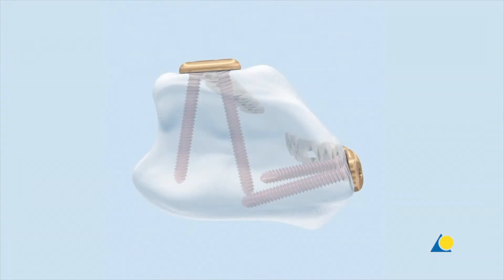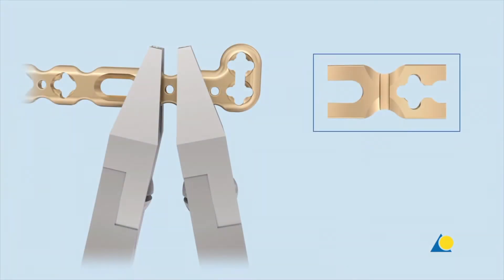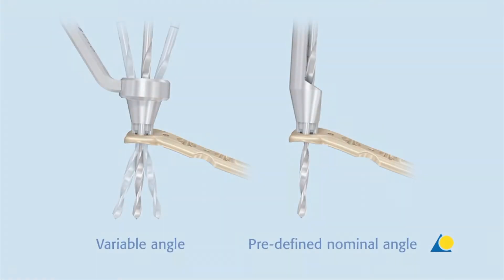The plates are positioned at an angle of 70 to 90 degrees to each other and are pre-contoured to minimize the need for contouring. If contouring is necessary, undercuts and bending notches allow easy contouring while preserving the variable angle locking holes. The funnel-shaped end of the variable angle LCP drill sleeve allows drilling at the desired angle, while the fixed angle end only allows the drill bit to follow the nominal trajectory of the variable angle locking holes.